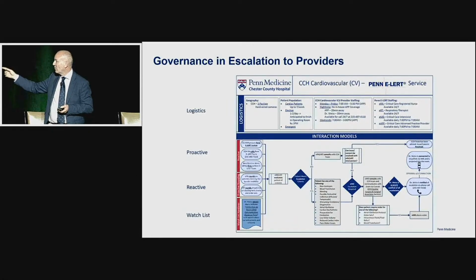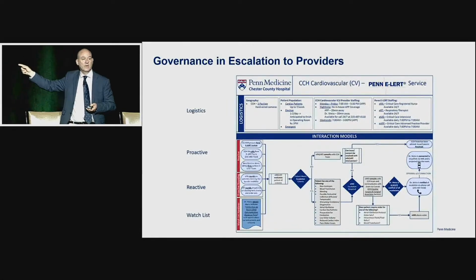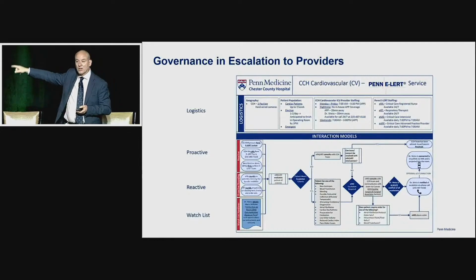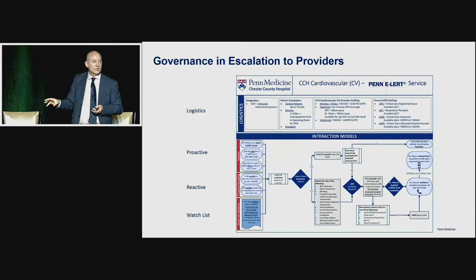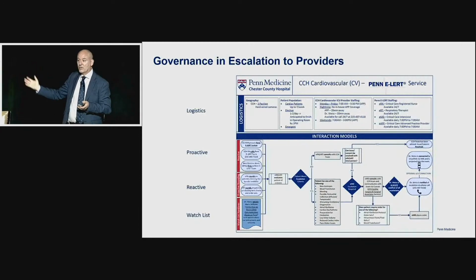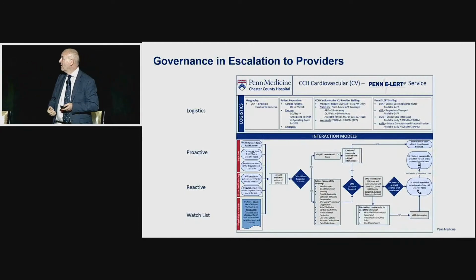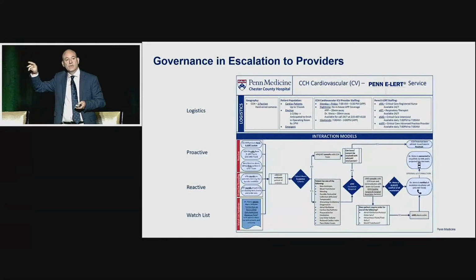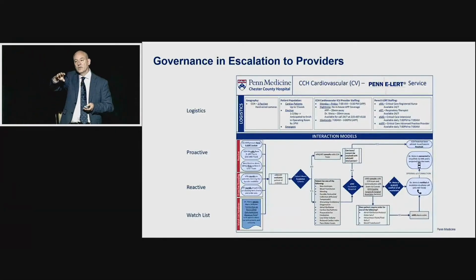And so this is a cardiac one, and you can see everything ends up going to the cardiac attending because that's what he wanted. So anything on that list in the middle, he wants to know about. So you can see that it's very powerful, and it's very different for each of the units, and it depends if we've got a fellow on a unit. If we've got a surgical critical care fellow, it's a very different algorithm to if you've got an APP-led system. And then at the top there, you can see we've got the patient population and what the actual staffing model is.